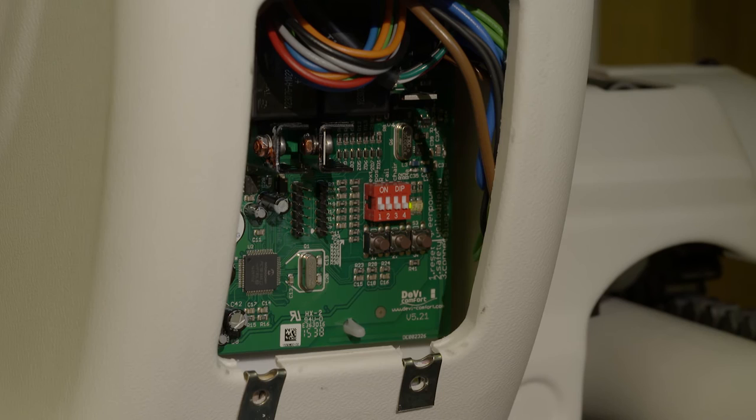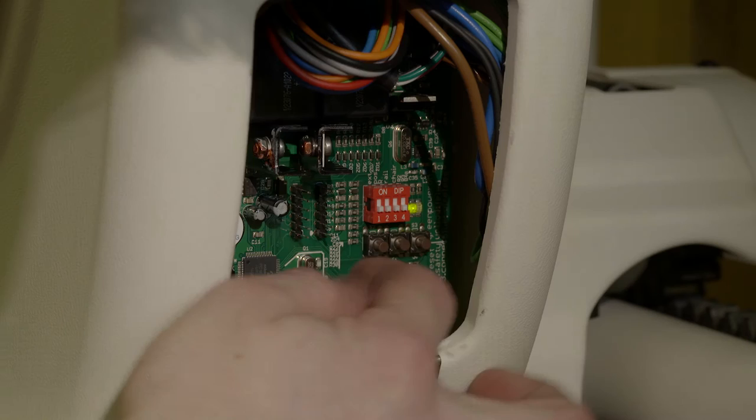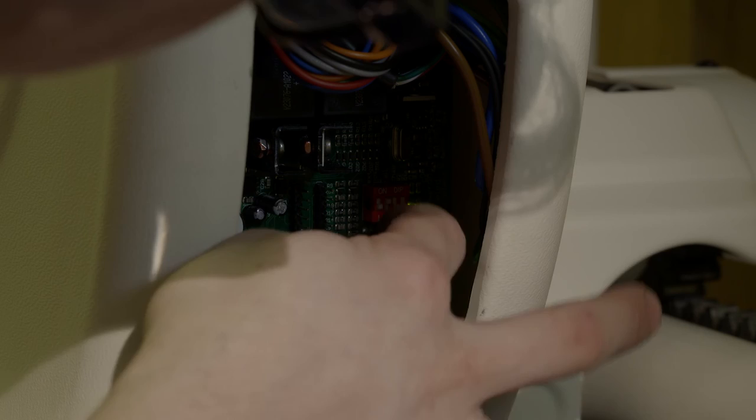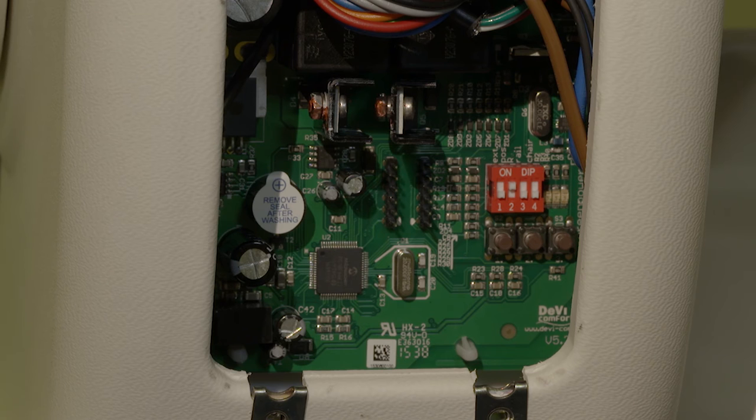To begin programming, start with calibrating the stairlift for either a left or right installation. Open the access panel on the right side of the carriage to access the main board. Then turn off the unit. Dip switch number 2 should be in the on position for a right-hand installation or off for a left-hand installation. All other dip switches should be in the off position.